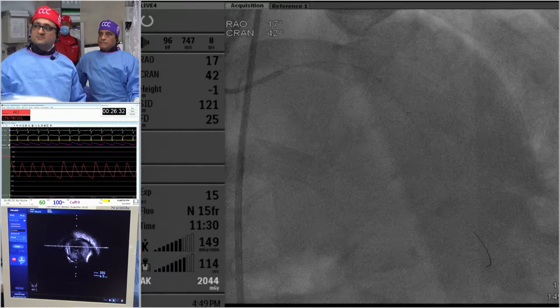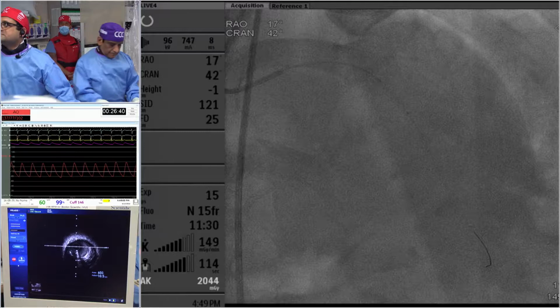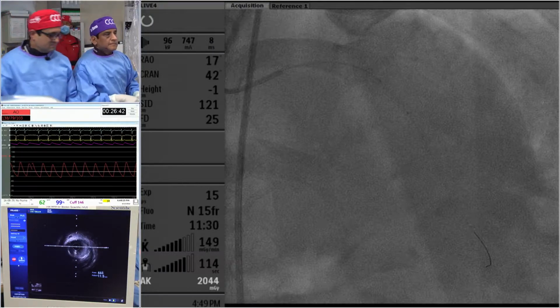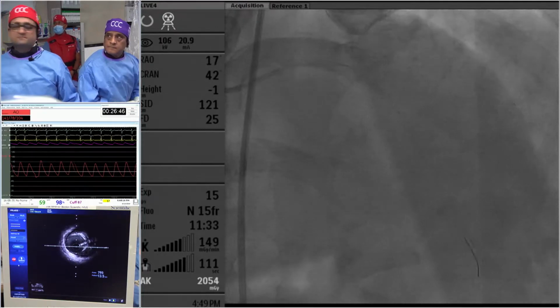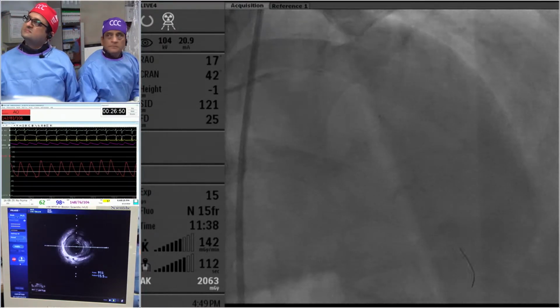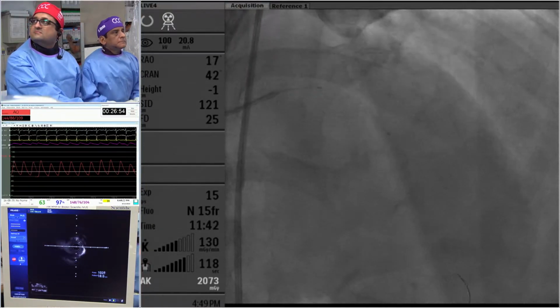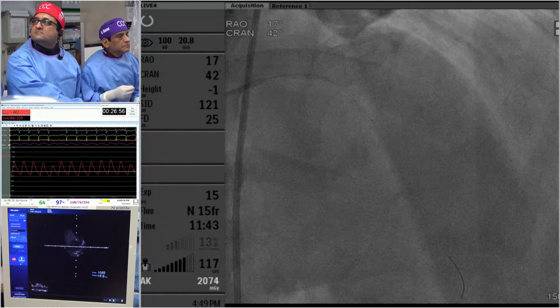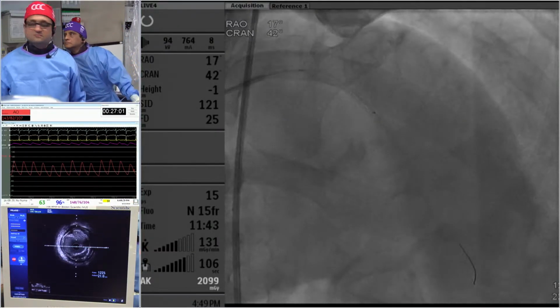Main screen, yeah. So this is the issue about these ulcerated plaques, that the lipid core has been disappearing. So what you have is a crater there. It's like an ulcer. And that's the difference between the ruptured plaques in humans in vivo, you always see that, versus the ruptured plaques in humans post-mortem, when you have the lipid core there and the clot on top. It's very interesting how survivors of acute coronary STEMIs, here, you have that ulcer there.